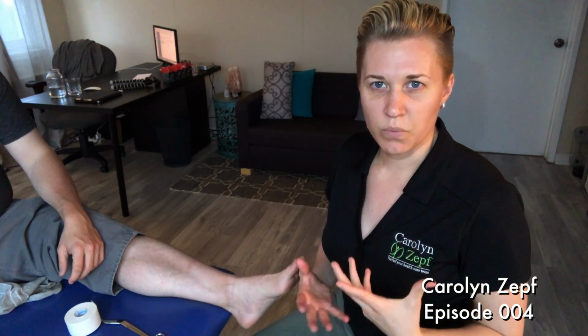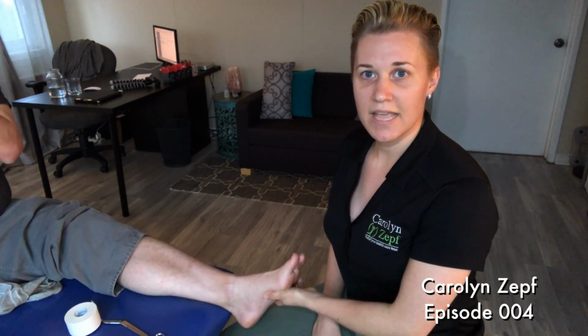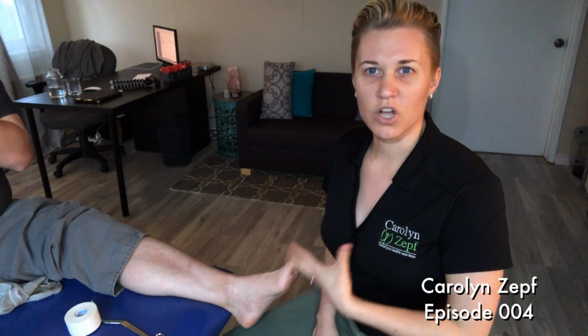One of my patients came in today and she's leaving on a trip, and we've been doing a medial support tape job for the arch of her foot. She really likes it and finds it very helpful. I was trying to look up a video of it online to send to her, but couldn't find what I was looking for. So I'm going to do a quick video of how to support and tape your medial arch of the foot, especially if you're pronating, dropping the arch of the foot, or getting any kind of medial arch pain.